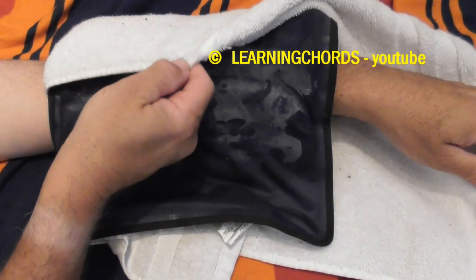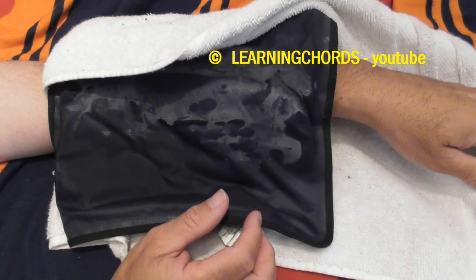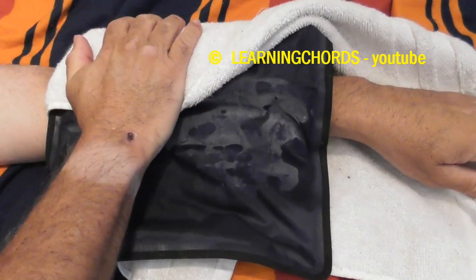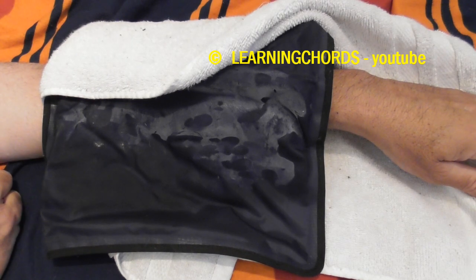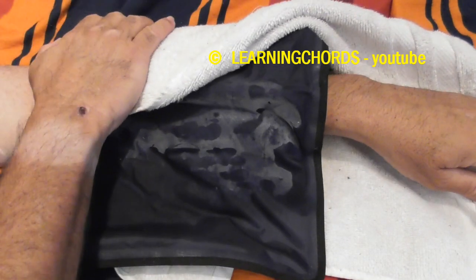And this is a bath, like a hand washing towel. You want to try to use a really thin kitchen dishwashing towel. So instead of having this big thick terry cloth, you want a thinner one. This is fine, this will work. I'm feeling the cold in the elbow right now, and it is doing exactly what it needs. But you might want to try different things, get a thinner towel, get a thicker towel. When it starts to not be as cold, just go direct skin.